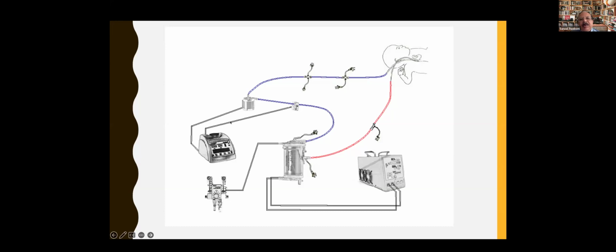is drawn up at the speed you want, at the desired negative pressure you want. But most importantly, you are measuring the flow here, how much flow you want. As they are proportionate, the machine will regulate that. So the pre-oxygenated blood is going to the membrane oxygenator, and from here, oxygen is getting circulated to the membrane oxygenator, and after the process of gas exchange, oxygenated blood is returning to the body at the right temperature. So this is all this cartoon is indicating.